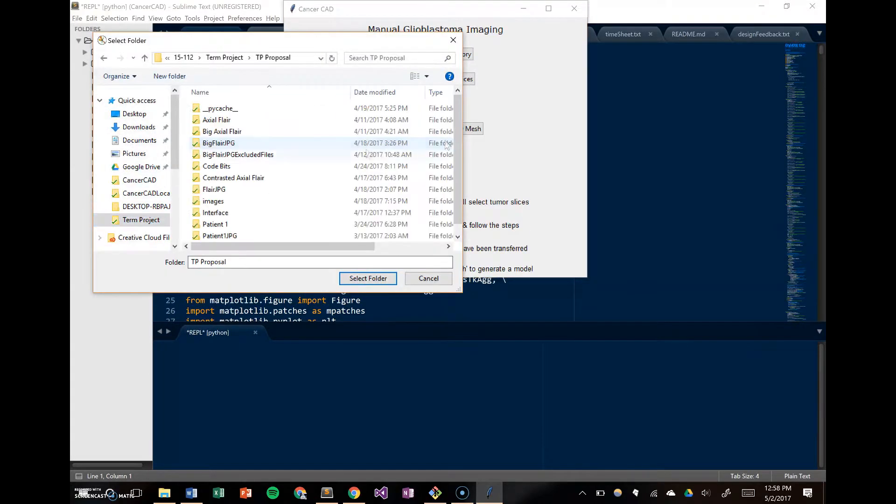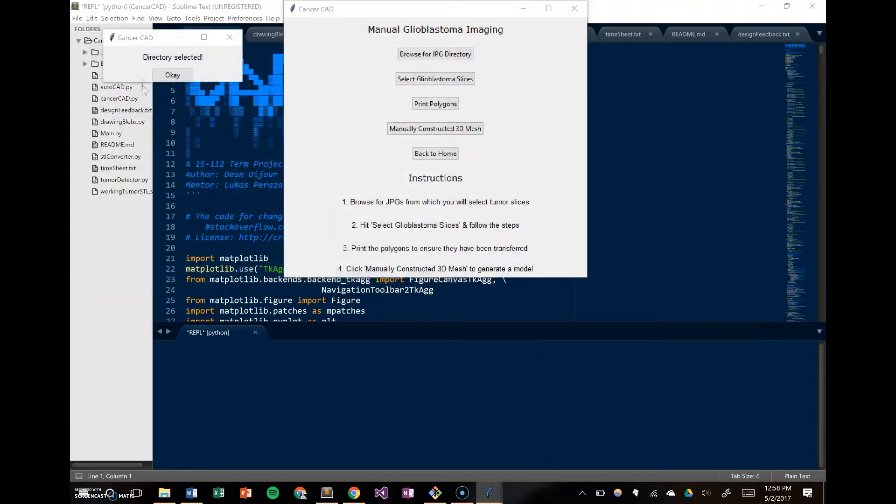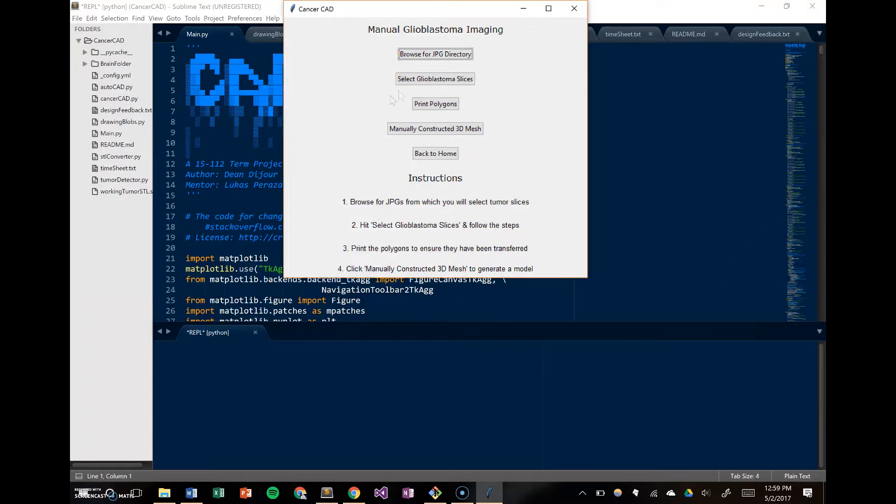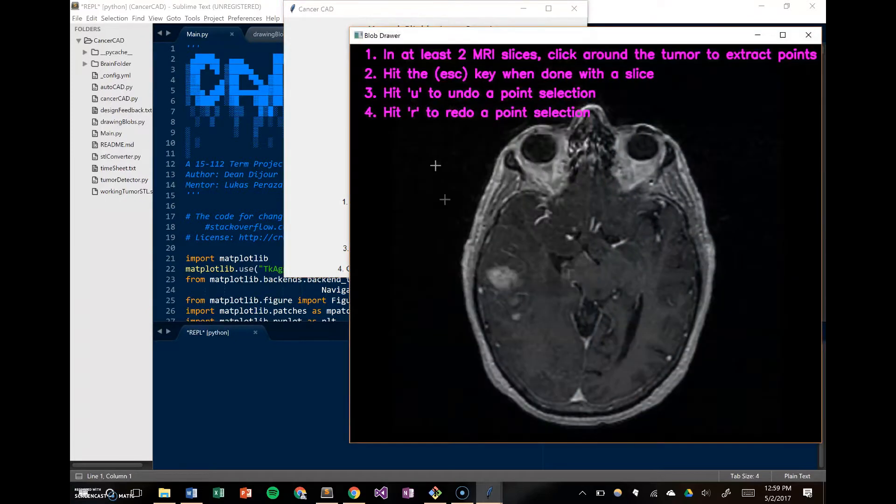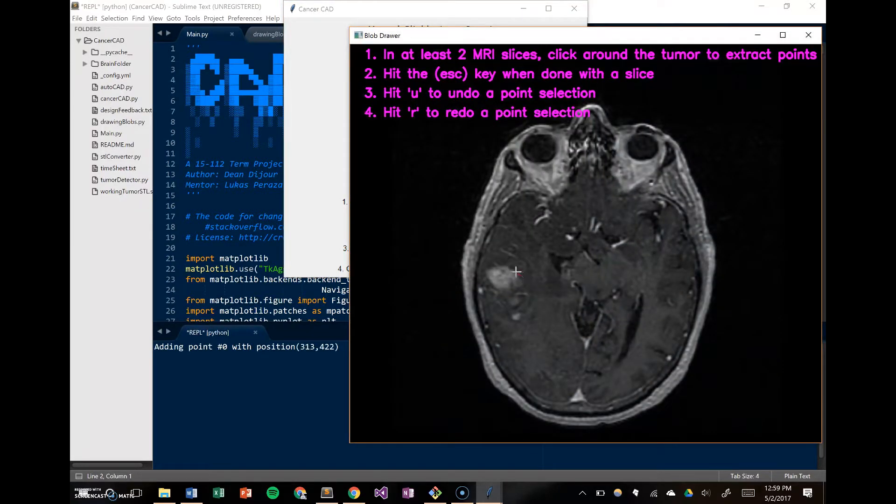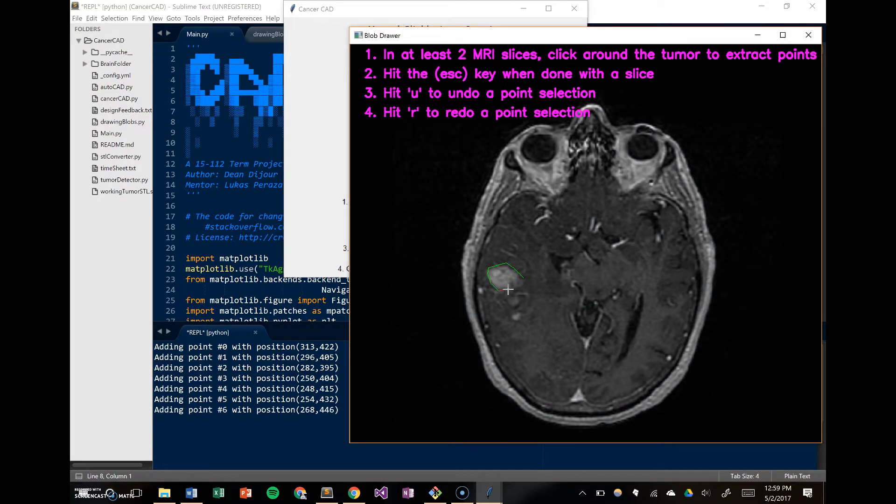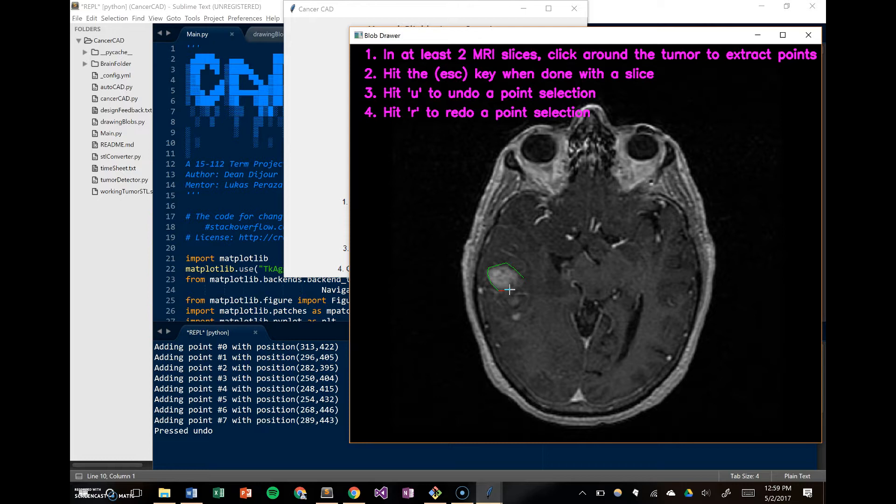Browse for the JPEGs you want to use. For you, it'll just be the brain folder, so it should be wherever you downloaded this repository. I have the same pictures here, just in a different folder name. Now what we want to do is select the coordinates of each slice of cancer. As I said earlier, you're going to be drawing polygons over the cancer.